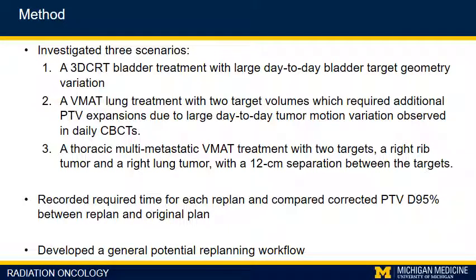To confirm that the EZFluence field-in-field replan was feasible, the corrected PTV D95% was compared between the replanned and the original plan. And also, a potential replanning workflow was developed to check if it would be feasible to do this replanning online with the patient on the table.